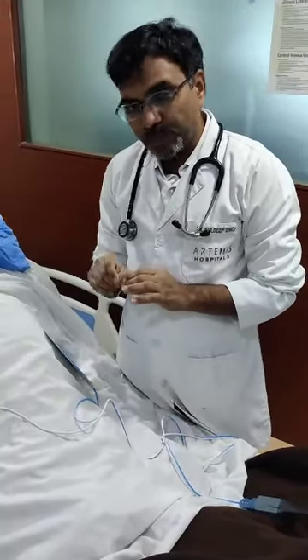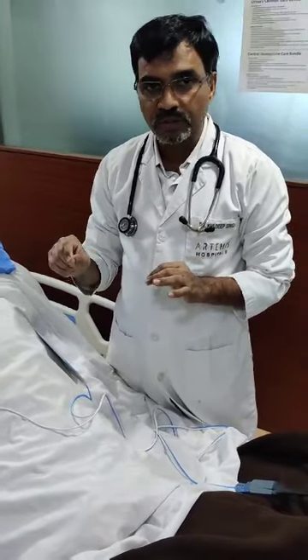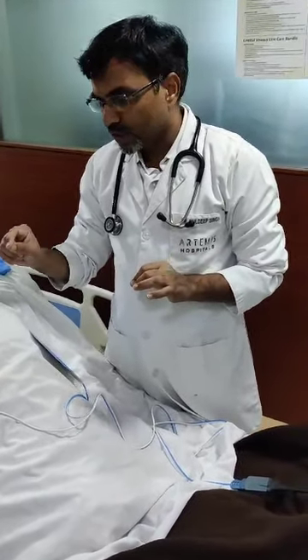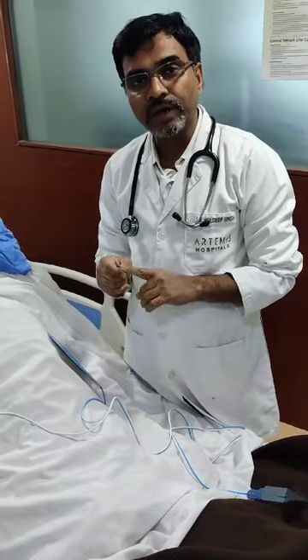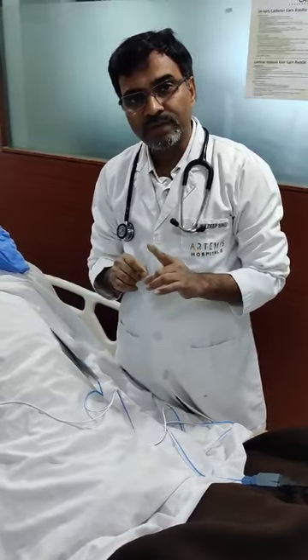We'll see the appropriateness of the patient selection. Suppose some patient comes from the emergency or some place, then we check that patient's heart rate is very low, bradycardia with hemodynamic instability, and I want to go for pacing. I'm not having transvenous pacing as of now, then I have to consider transcutaneous pacing.